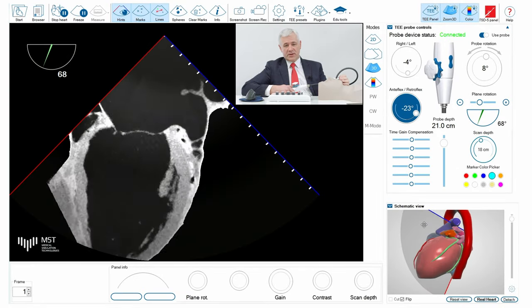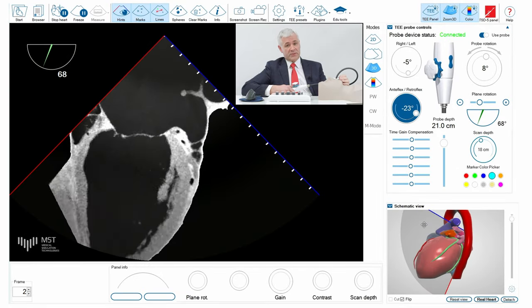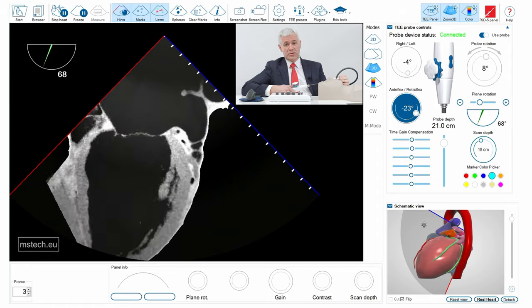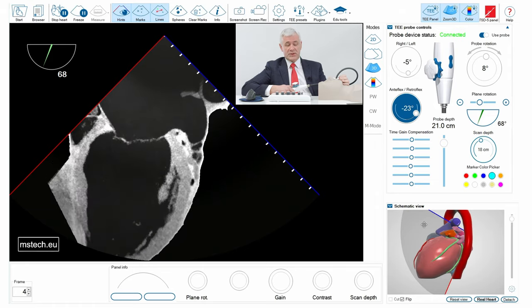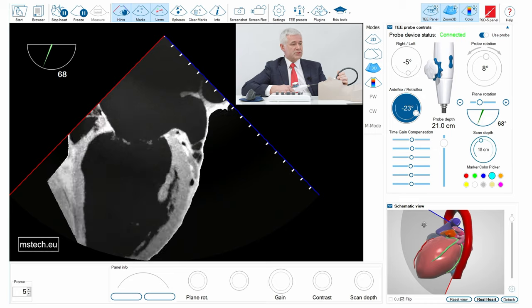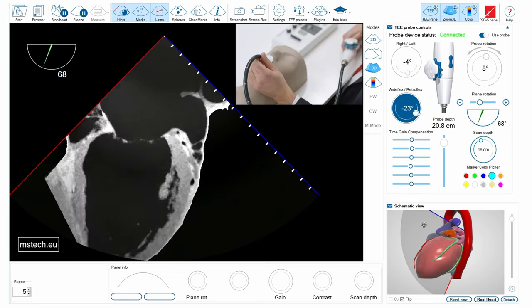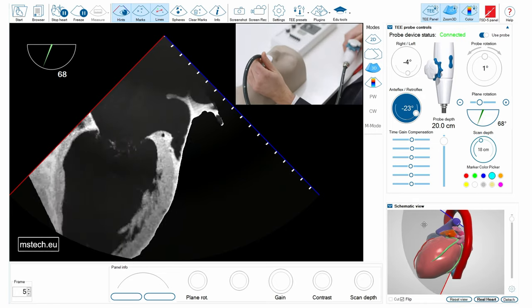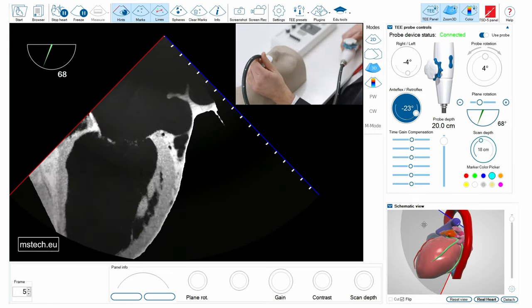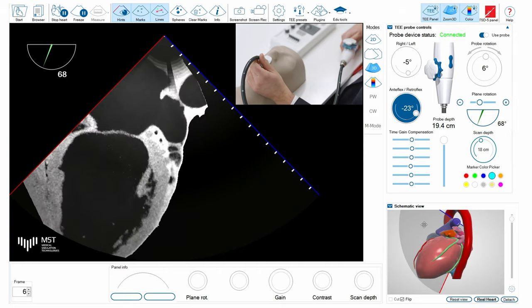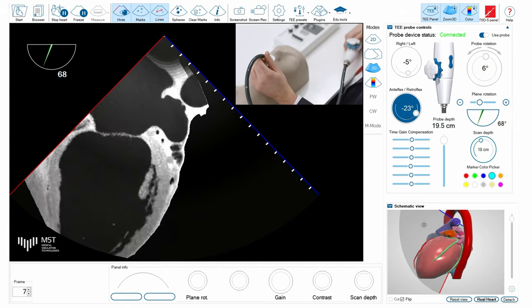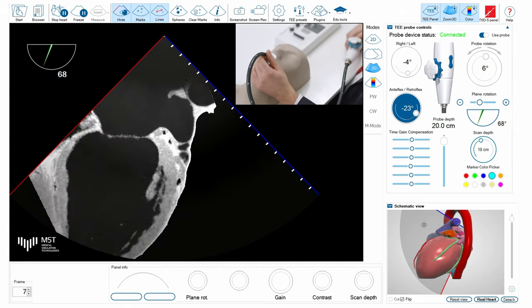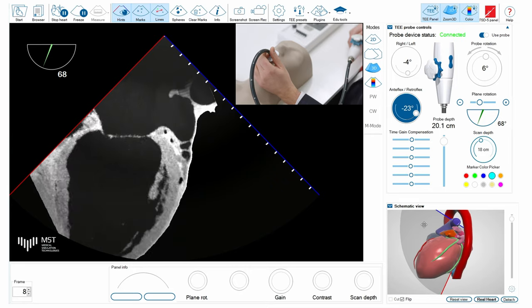Proper scanning of the left atrial appendage is very important to either confirm or exclude presence of thrombus or different devices in the left atrial appendage. Here we have an image of the left atrial appendage, usually acquired once you insert the probe to the mid-esophageal position.